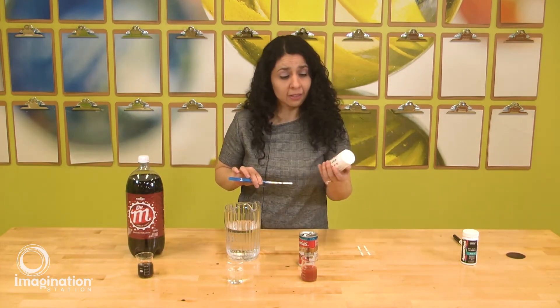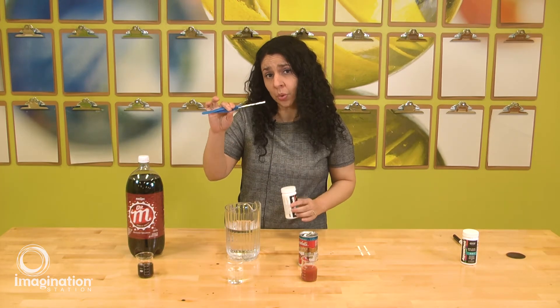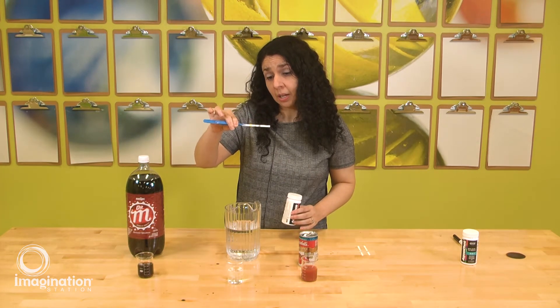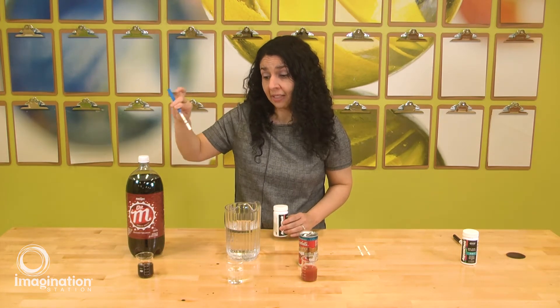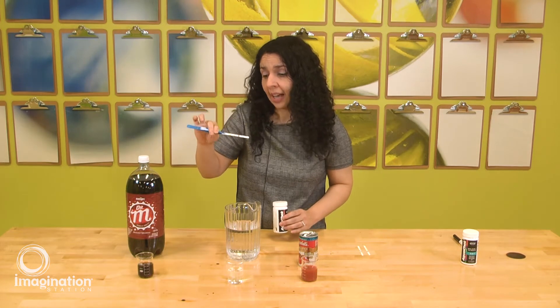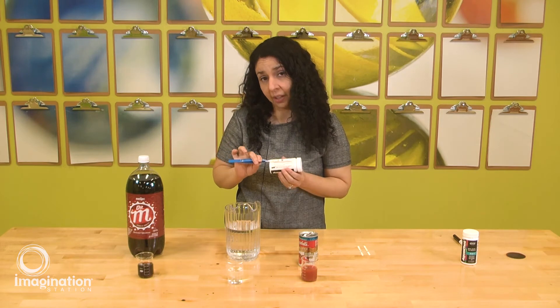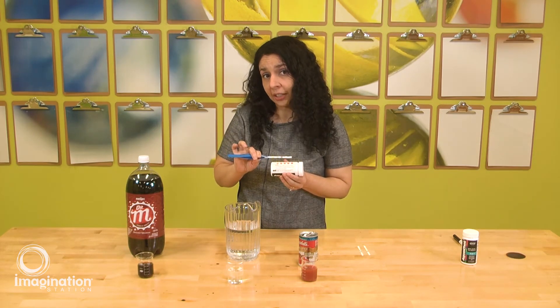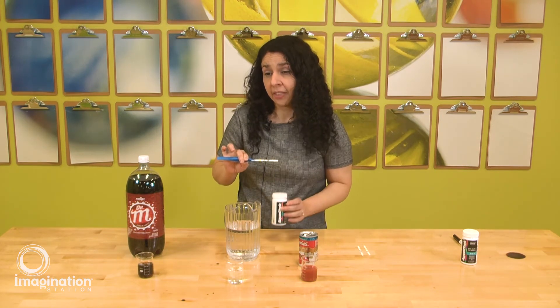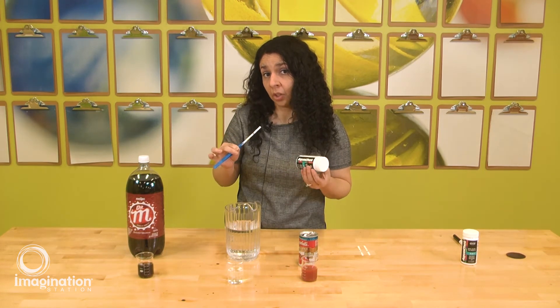You guys are going to be receiving specific pH strips in your kit. We're going to insert them briefly, and every time we do it we take a new one. The color of the strip is going to change, and we'll compare that with the legend in your container, which will tell you if the pH is acidic, neutral, or basic.